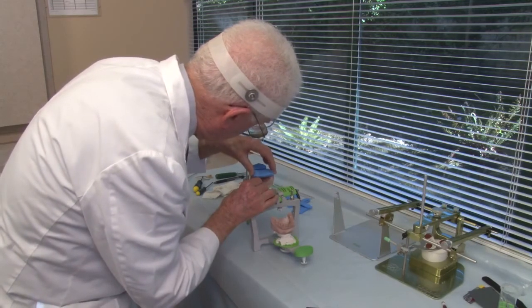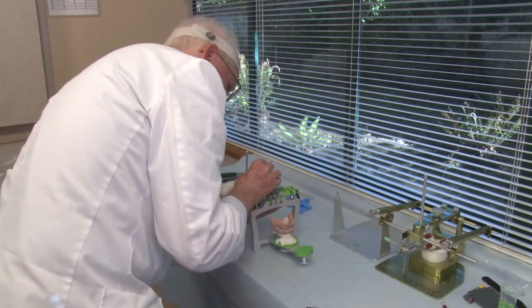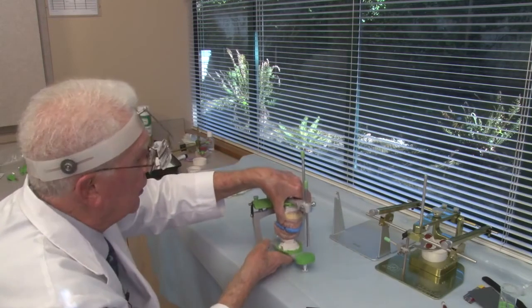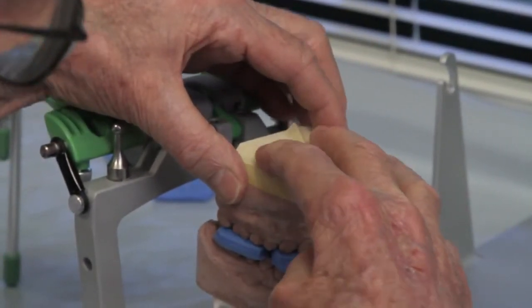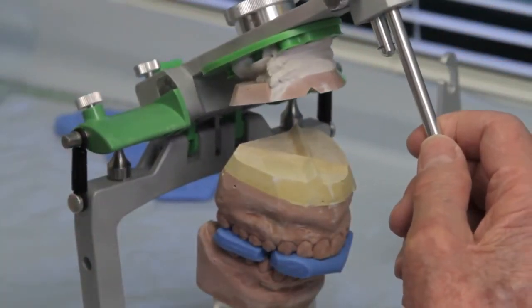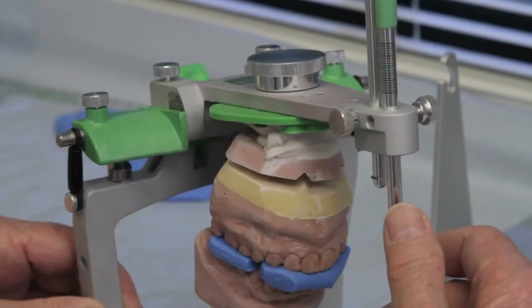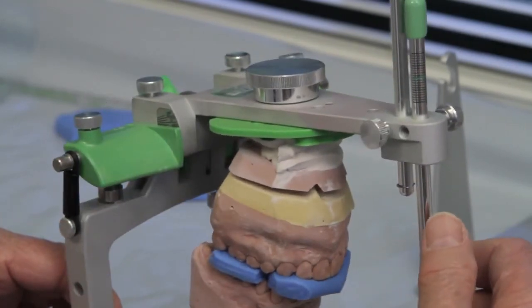See, I'm even having trouble trying to locate exactly where it fits on the model, because the indentations of the teeth weren't that clear. But I got it. Let's close. Invert it. Seat the wax, seat the model in the wax good. And now we'll close it down very slowly. Now it's touching there. So that's an inaccurate set of wax bites. It doesn't match the ones that I've already proven are correct. So you see how it doesn't come together.